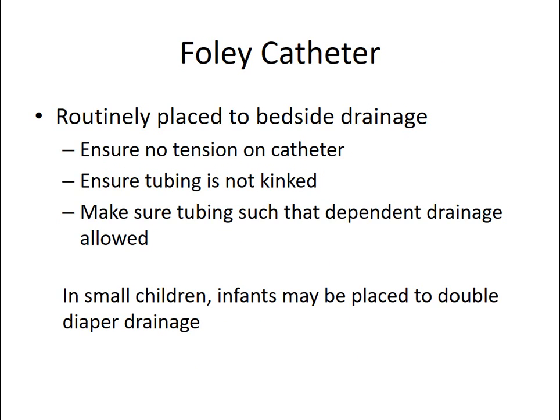So, Foley catheters are typically placed at the bedside for bedside drainage, and a couple things that we want to be very careful about. We cringe when we see the dangling catheter. It can get stepped on if it's attached to a bag and they're moving. It can put tension on, particularly if it's a male urethra. That can potentially put a child at risk for strictures. Pediatric urethras are extremely sensitive. If they're dangling and not accurately secured, again, it can lead to kinking.